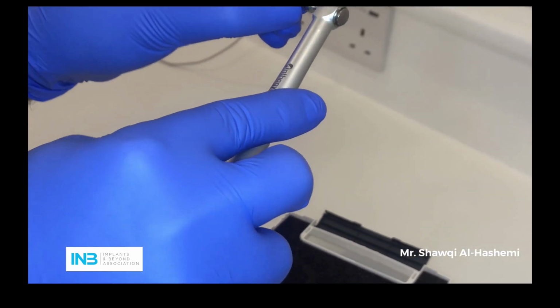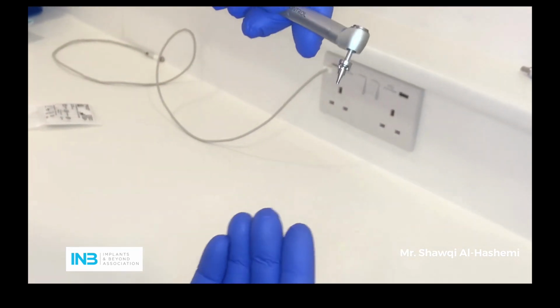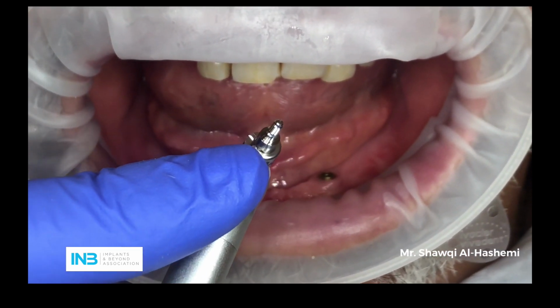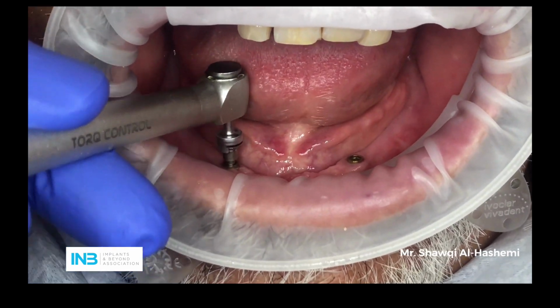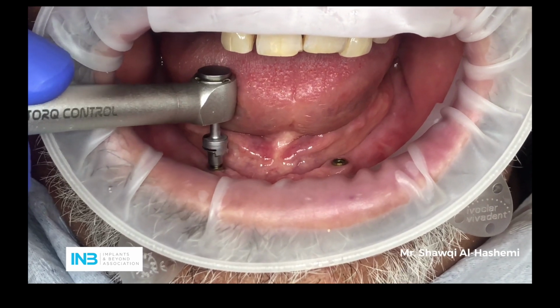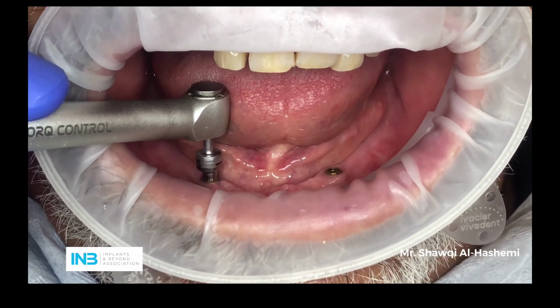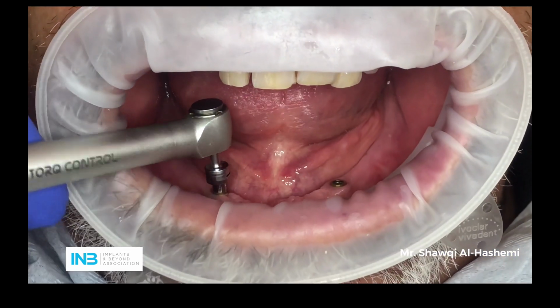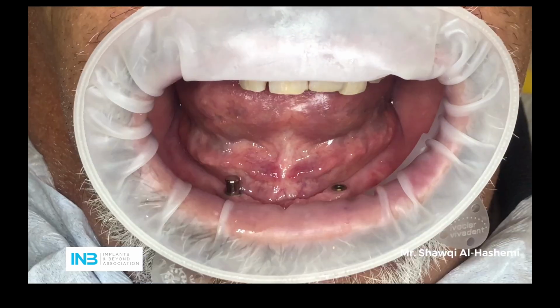So we're going to demonstrate how we're going to fit this abutment now on top of the implant. As you can see, it slides in this way and it locks, so it doesn't fall off. All right. As you can see, and we have demonstrated previously, this is the abutment. Now we're just going to gently engage it like this, and that is going at 10 Newton. So that's one for now. And of course, all you need to do is just slide it out just that way. Okay, that's good.